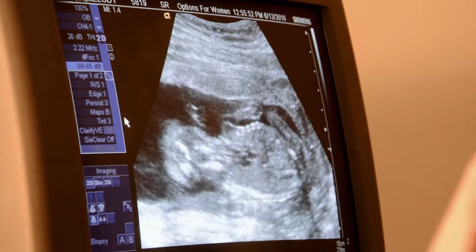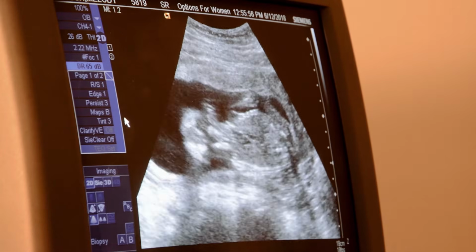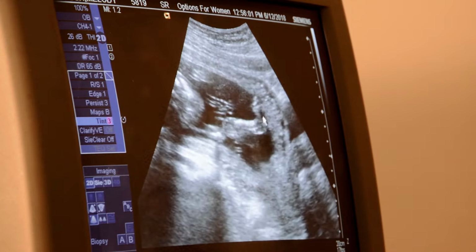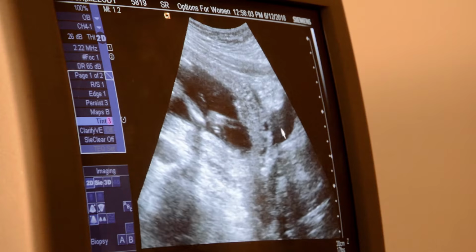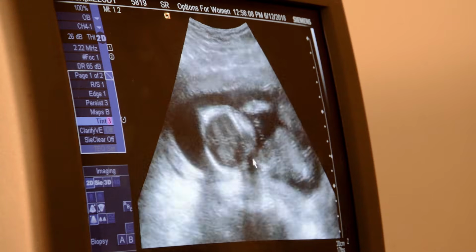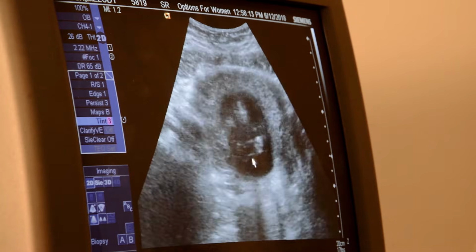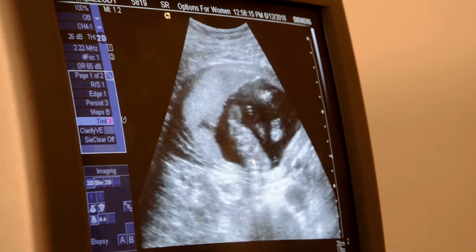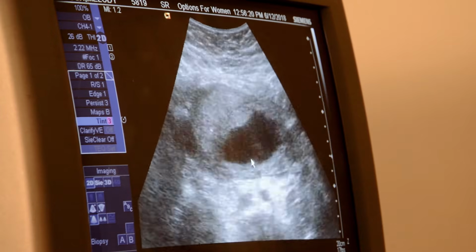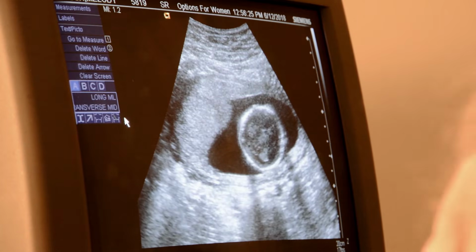Okay, so time to get back to work. We're done playing for a minute. Let me just show you guys. I'm going to let you take over. Here's the foot. Oh, that's so cute too. Here's the bladder, like you did, and the cervix, the lower uterine segment. We took the fundus already. We go transverse. Start inferior, angle up, go all the way through the baby until you're all the way out. And then go ahead, transverse, and take transverse.